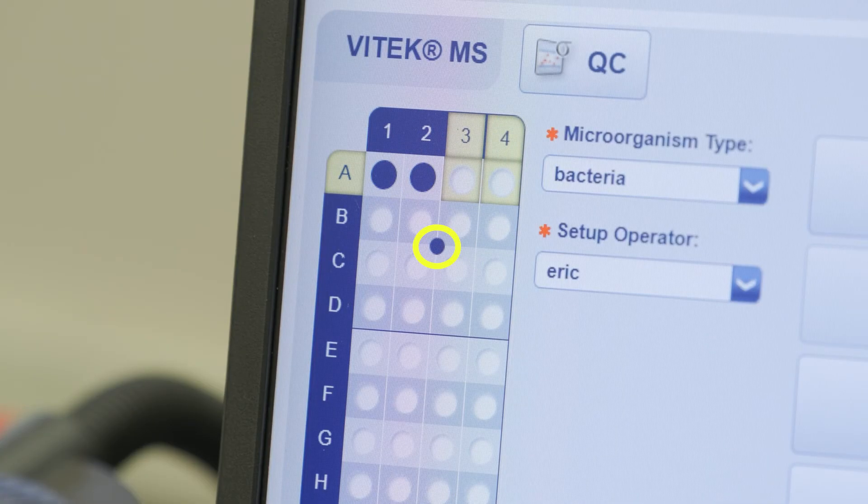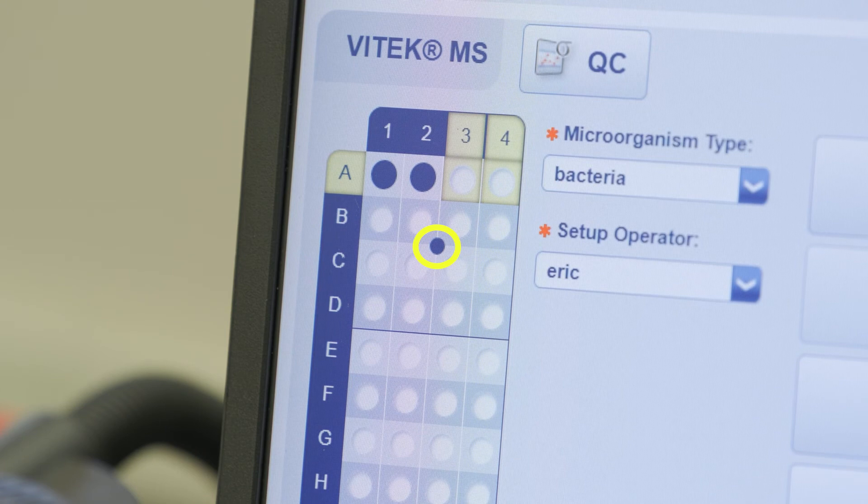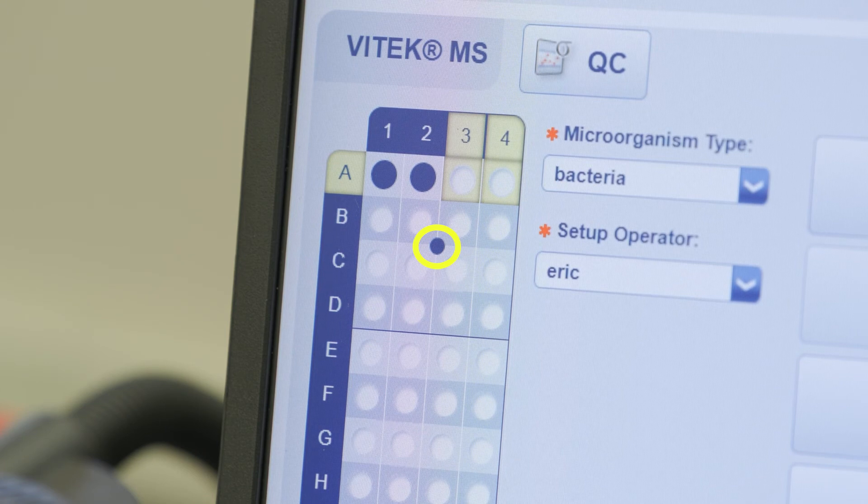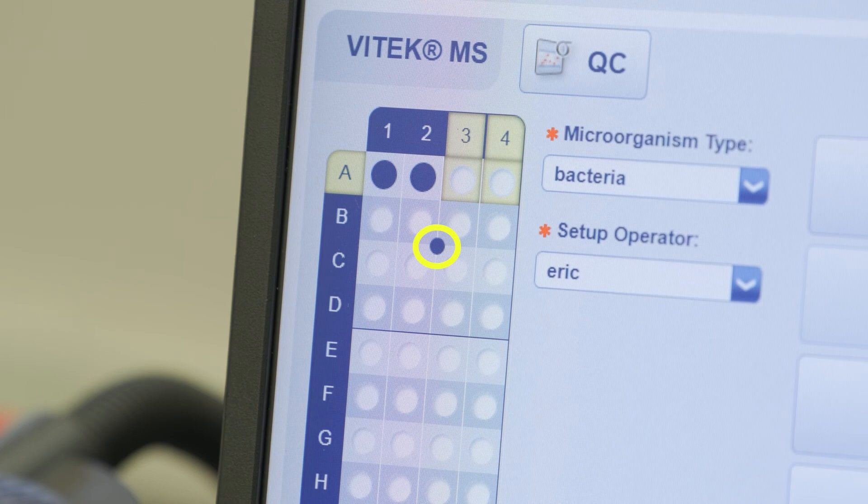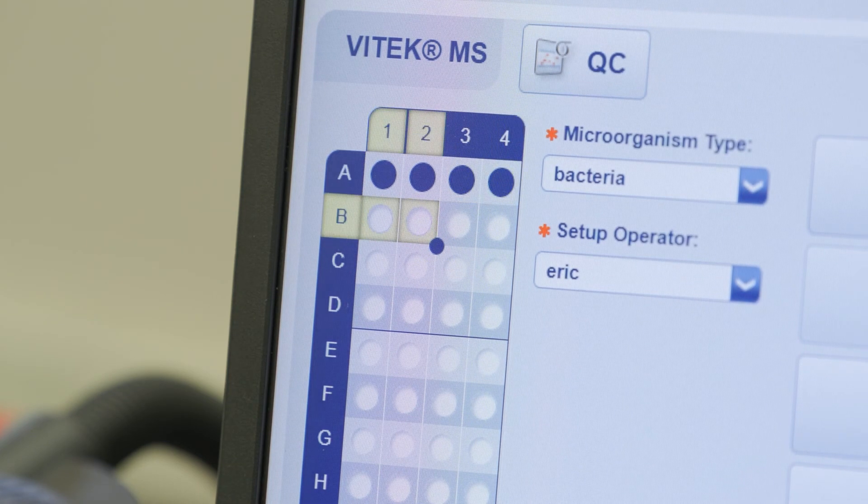Once the first sample spot is identified, the Vitec FlexPrep software indicates the calibration spot of this acquisition group as filled automatically. Repeat these steps until all desired spots have been defined.